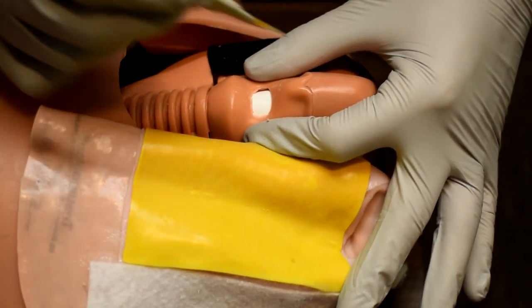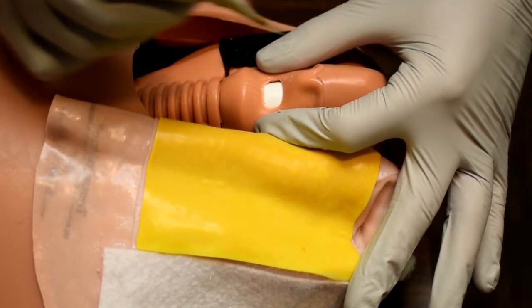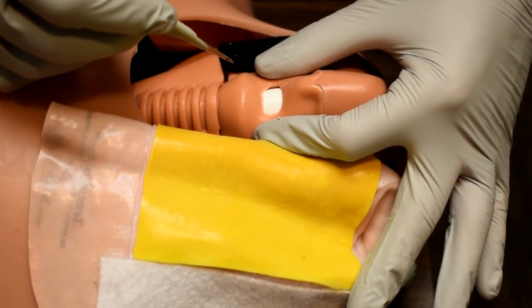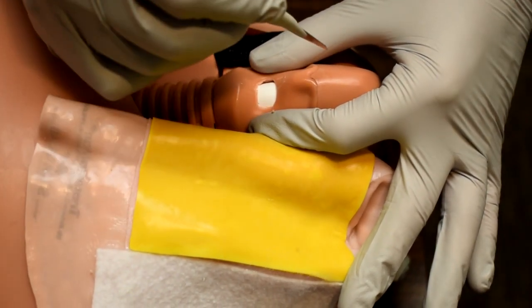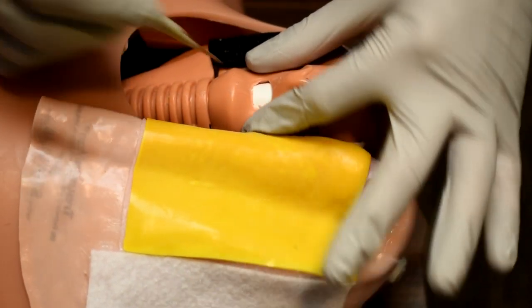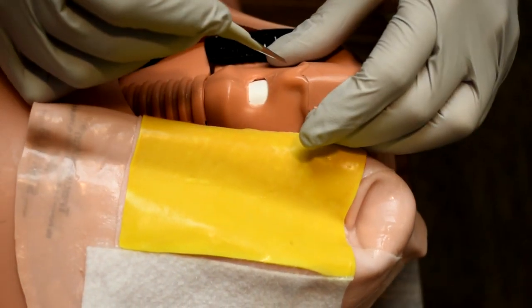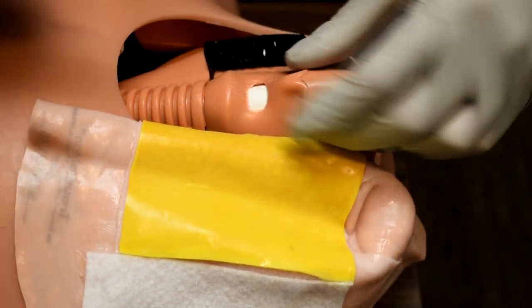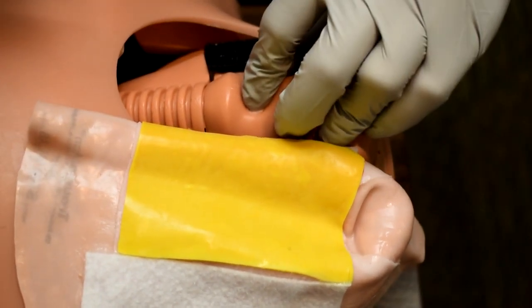So the first cut is going to be over the cricothyroid membrane that we have identified. And we make a large cut. This is not a time for a small cut. This is a life-saving procedure. So you're going to cut through the skin and you're going to continue to cut down until you can feel that you've cut all the way down. So it's a motion of going back and forth. Cut, stick your finger and feel, cut, feel, cut, until you feel that you're at the cricothyroid membrane.